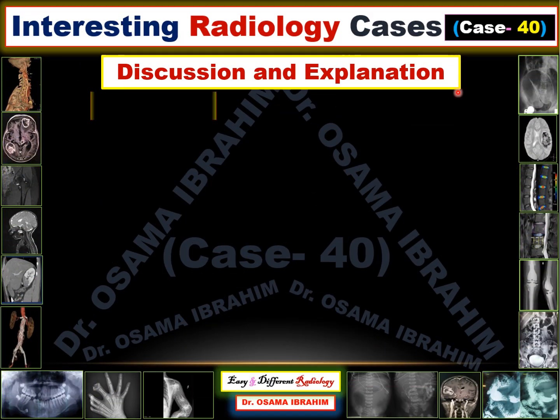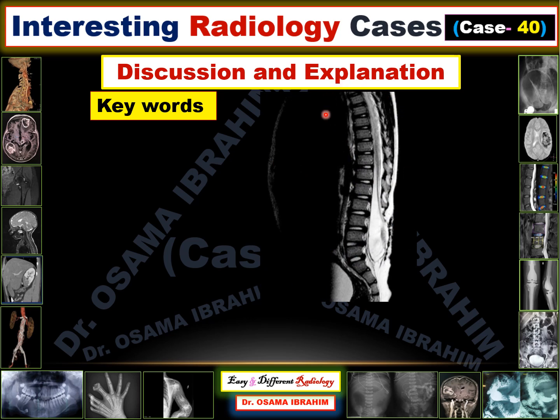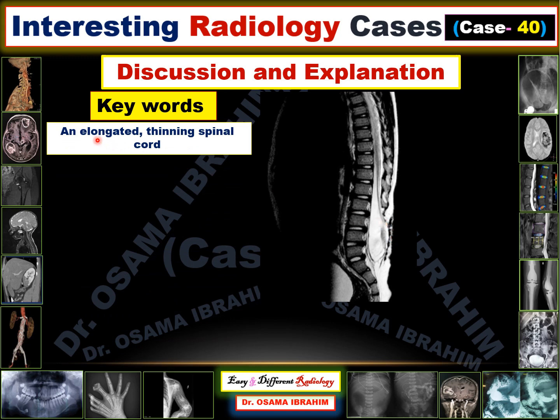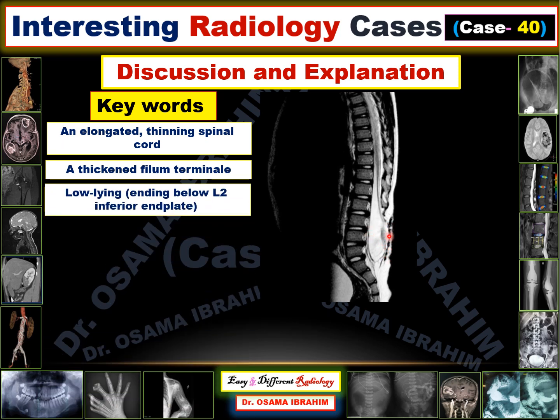Discussion and explanations. The keywords for this case: sagittal T2-weighted MRI imaging showing the cord in an abnormal position. There is elongation and thinning of the spinal cord with thickening of the filum terminale. The low-lying spinal cord appears at the level of L2 inferior vertebral body, which is not normal because the normal position is at the level of D12-L1.